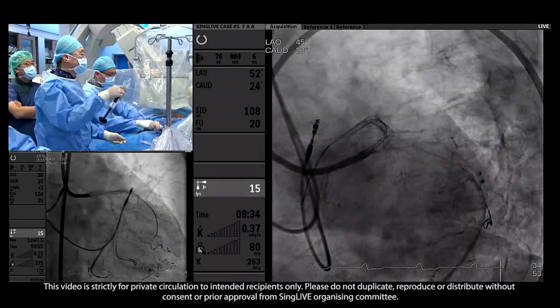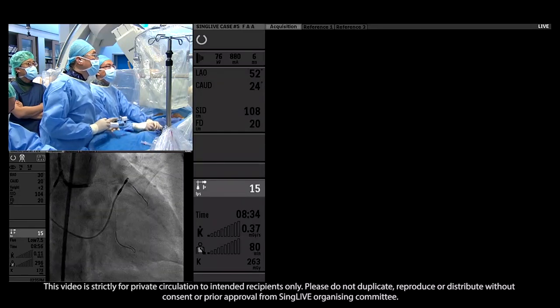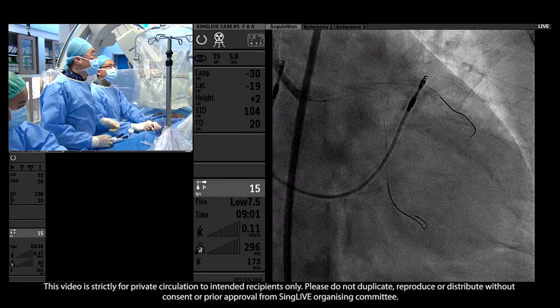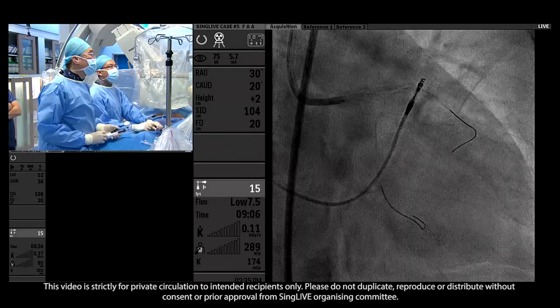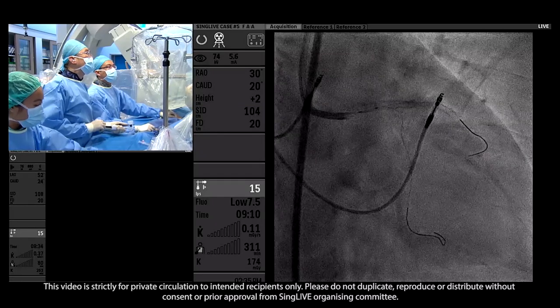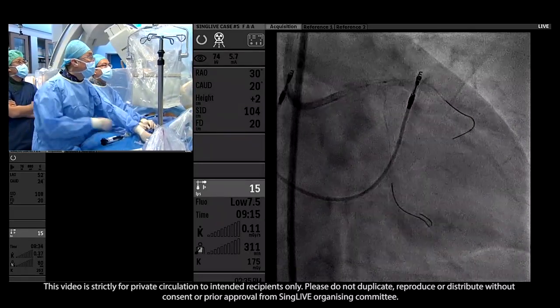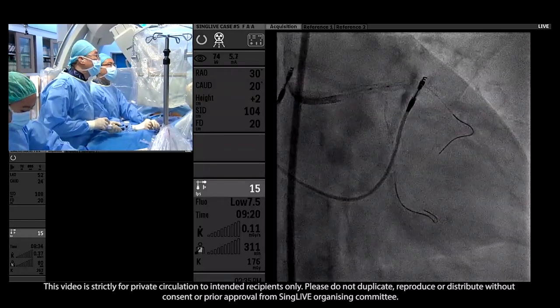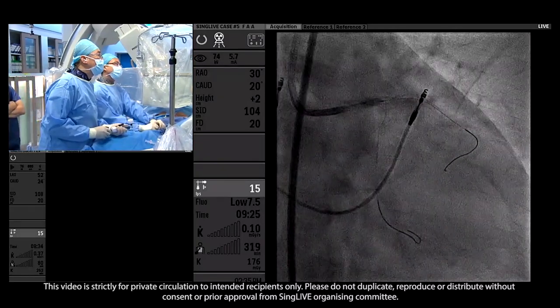According to the relationship with the tip of the guiding catheter, I think the stent didn't cover the ostium of the LMCA. So I want to check the IVUS. They're going to do a POT here at first. After IVUS, we can post-dilate the ostium of the LMCA. IVUS first. Gentle, and we overlap a little bit here. Maybe a 12 here.